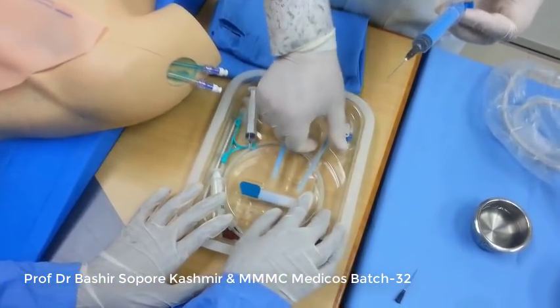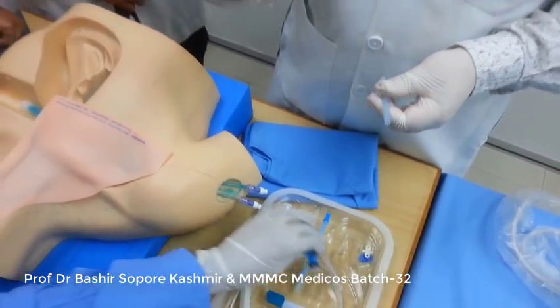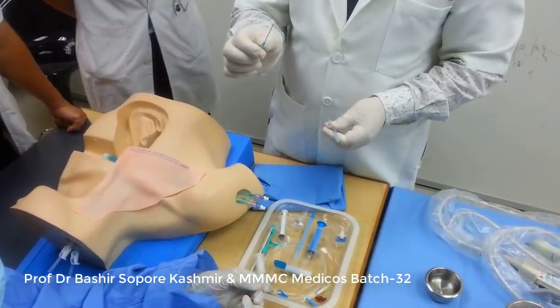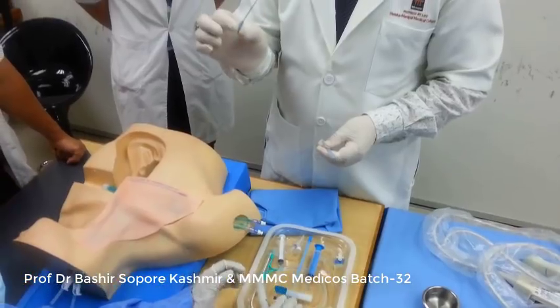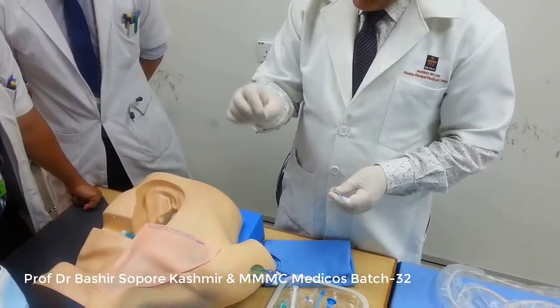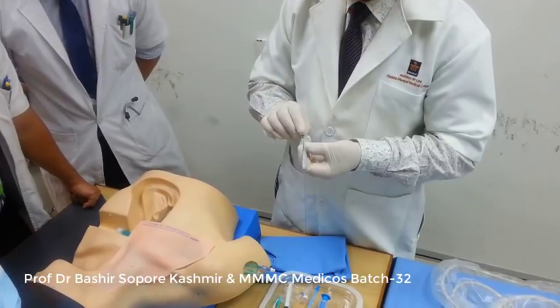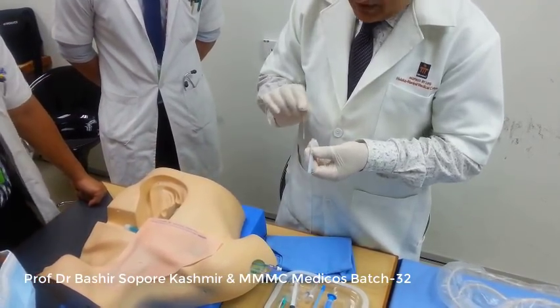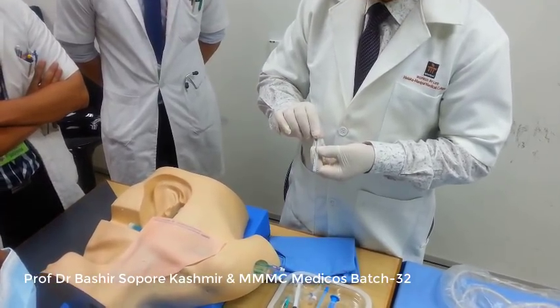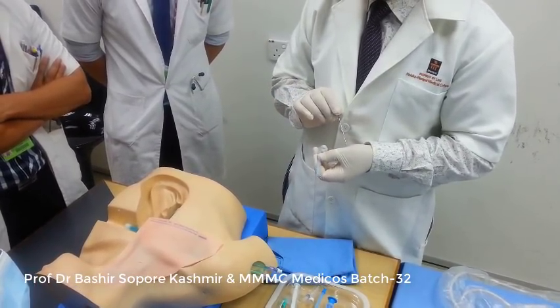And when I say needle finder, the other needle is called the needle introducer, and this needle introducer is about 2.5 inch in length, and it is an 18 gauge needle. So it is a big bore needle, which is to be introduced after the needle finder in the internal jugular vein to withdraw the blood, and then through this we can enter the catheter.